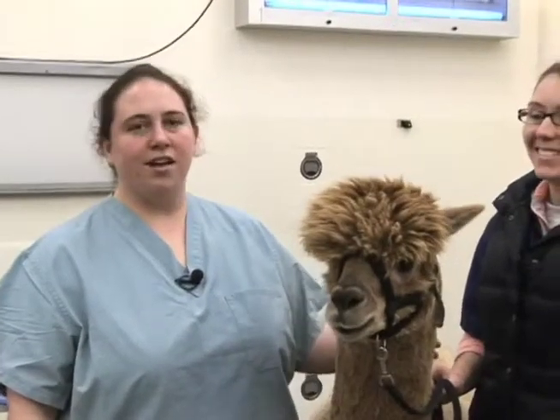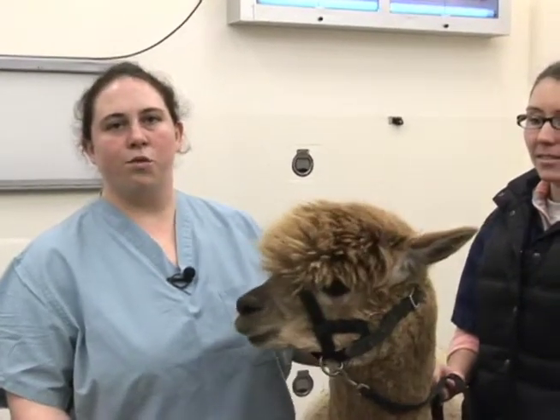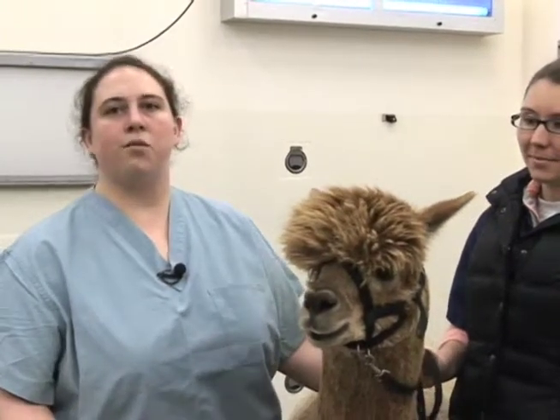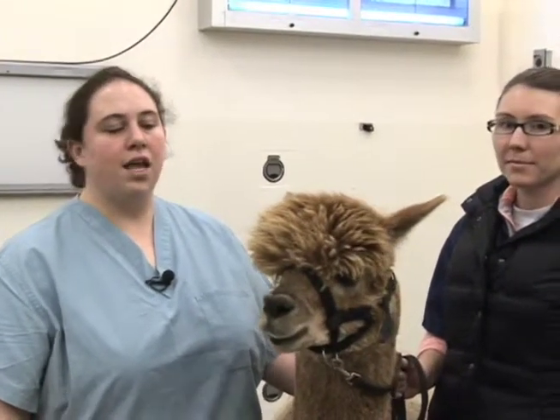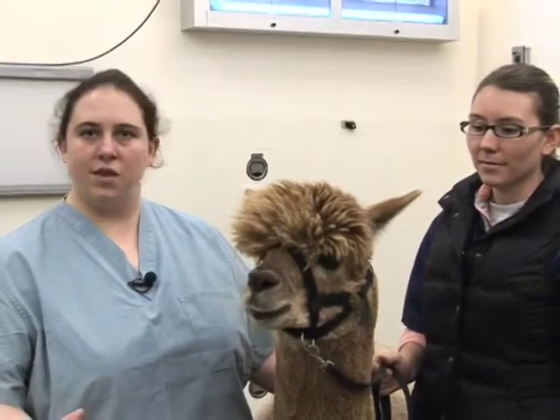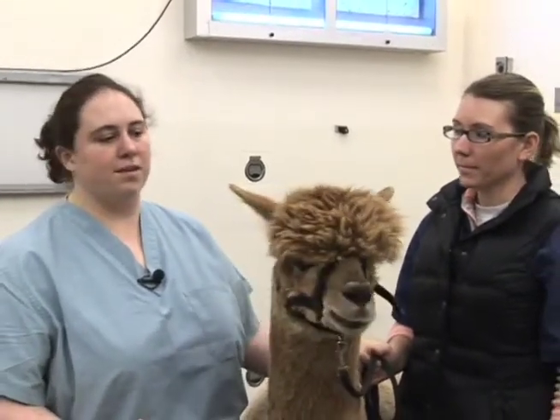Today we have Macchiato and he's going to be our assistant to demonstrate the removal of fighting teeth. Much like Macchiato, most of the time when we think about removing fighting teeth it's in males. However, females do occasionally get teeth of a size and curvature that necessitate removing them, so that can be something you may be faced with at some point.